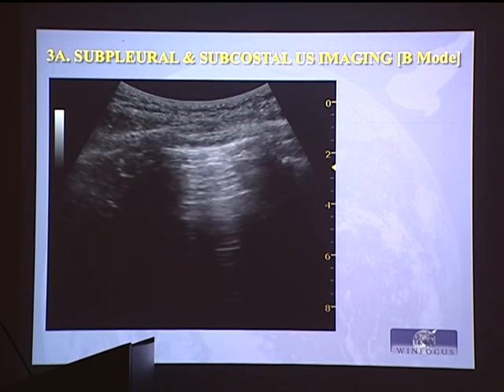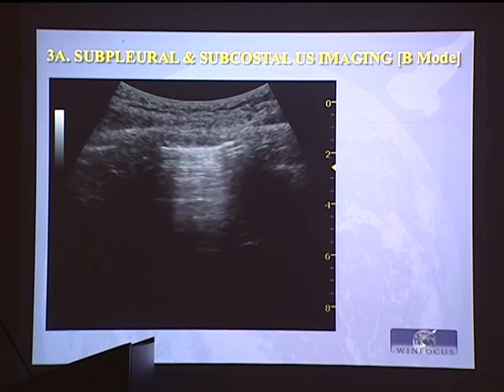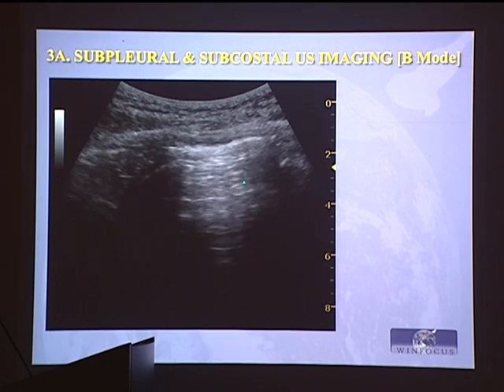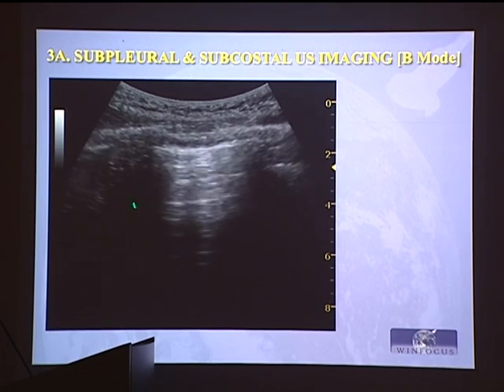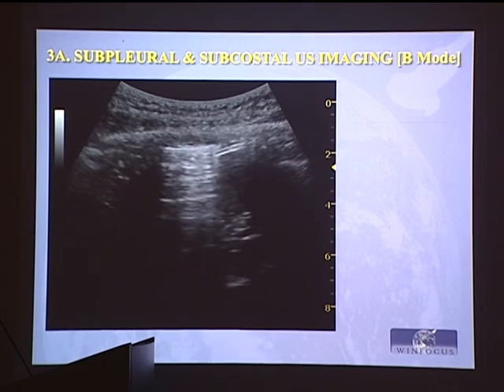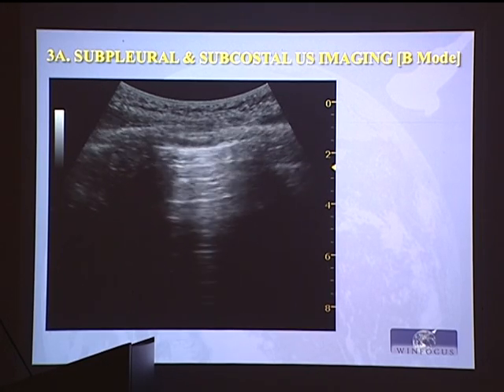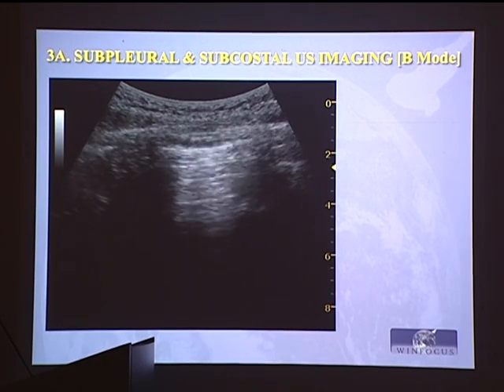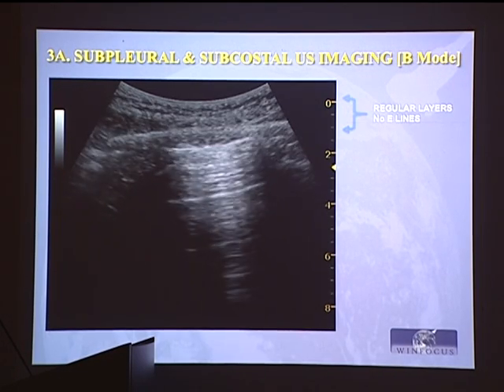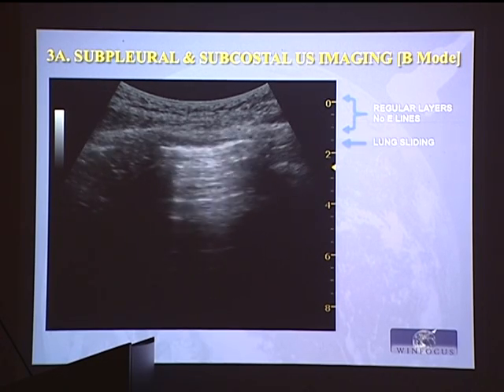What about the physiopathology interpretation? No subcutaneous emphysema, lung not collapsed by free air, not collapsed by free fluid, mobile and dry, because there is just air in the lung. And I know that this lung is dry, so no pulmonary edema, no RDS, no superficial pneumonia, no pulmonary fibrosis that would create other patterns than this dry pattern. So the septa are not thickened and the alveoli are dry.